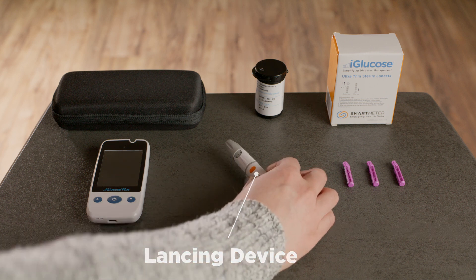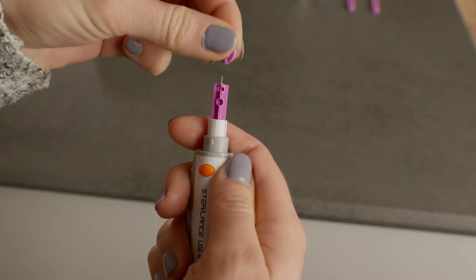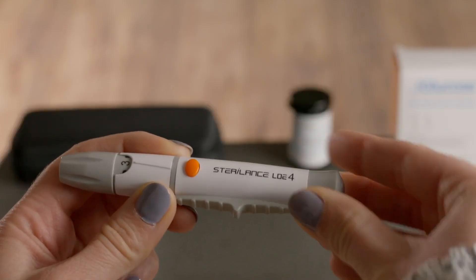First, let's prepare the lancing device. Remove the cover and insert a sterile lancet. Remove the safety tab and adjust the puncture depth to your comfort. Pull back the cocking barrel to set the lancing device. It's ready to use.